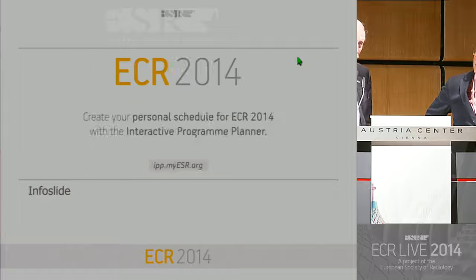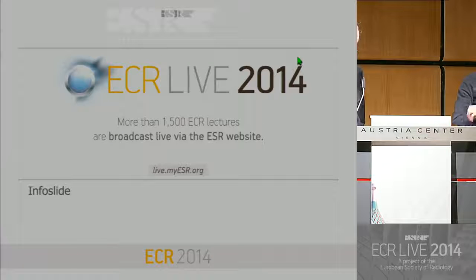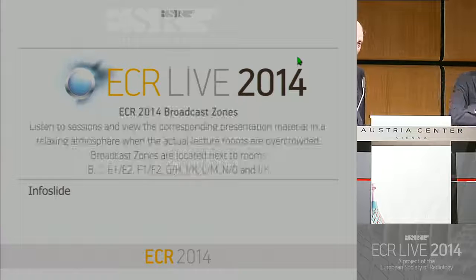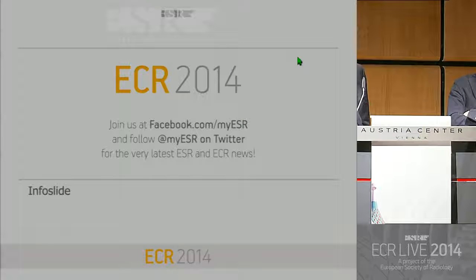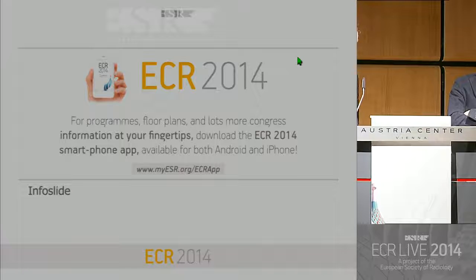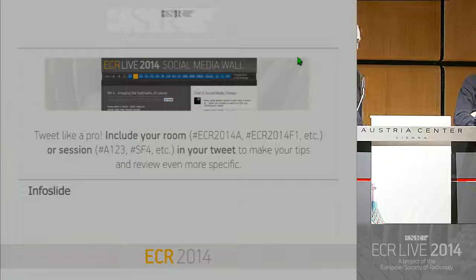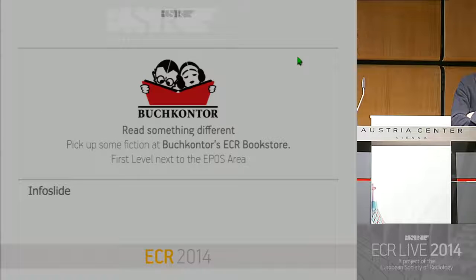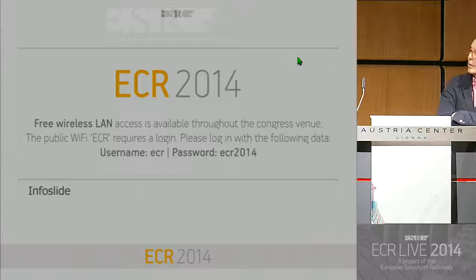That is confirmed in the big study reported by Siddiqui in 2013 in the JNCI, the 536-case MRI study conducted at the National Cancer Institute. His conclusion on similar findings is that at the moment, the recommendation should be to do the 12-core biopsies and the MRI biopsy, because of missing too many aggressive cancers in the low-risk group of the MRI biopsy. Would you comment on that?